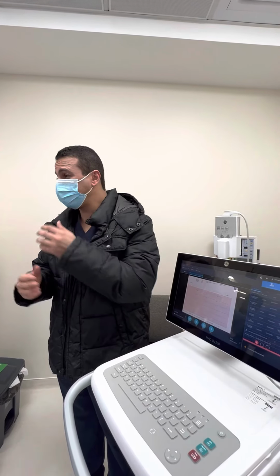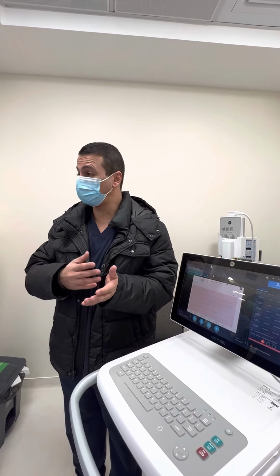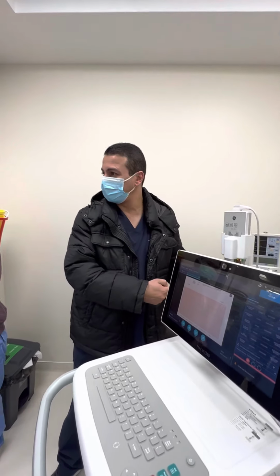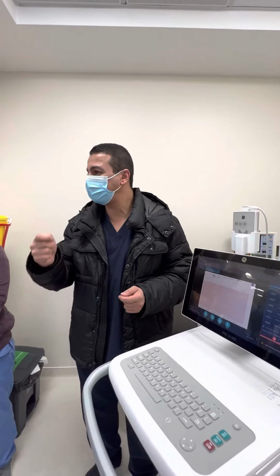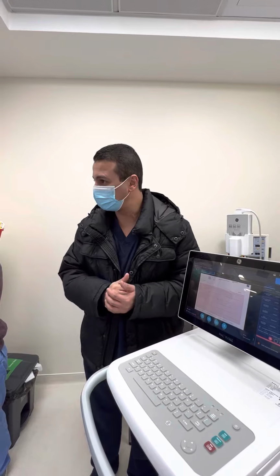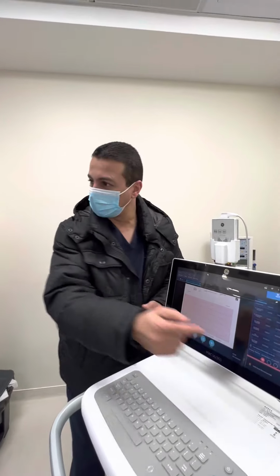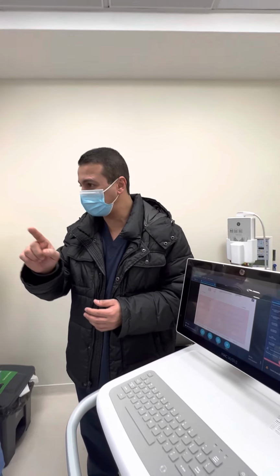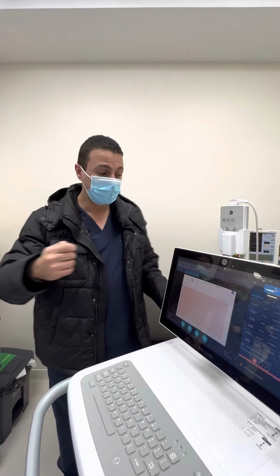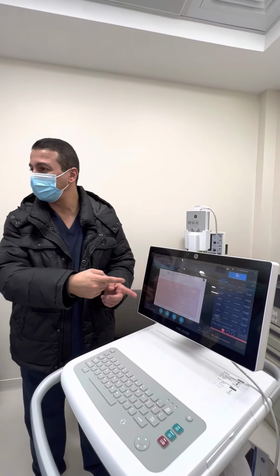Exactly. So the machine has an option actually in here to run an auto ECG. So we can turn it on. So you can use that time. You will hook up your patient as we are in the ER. The machine will detect the best 10-second signals, then acquire an ECG. Then you have to accept or reject. That will be good. Yes, so we can turn it on. That line will run for 10 seconds, the best 10-second signals. While you are asking your physician to place an order or you place an order over there, you can hook up your patient, check the signals, place an order, get back, you will find the report acquired already.